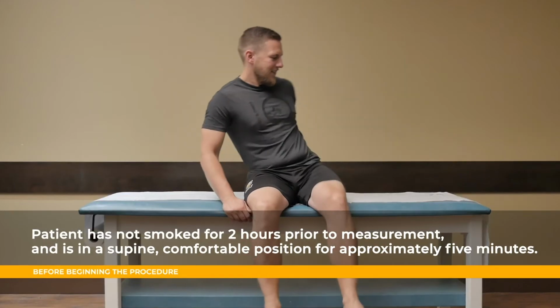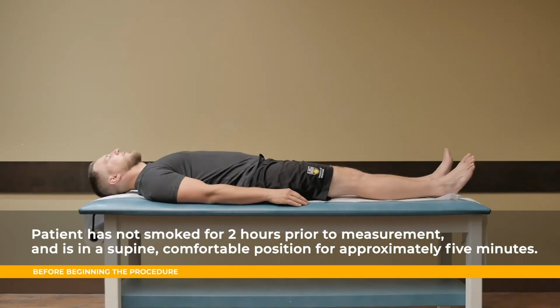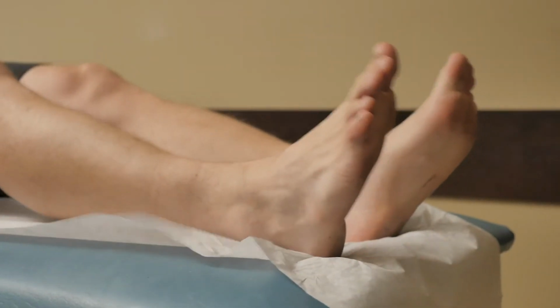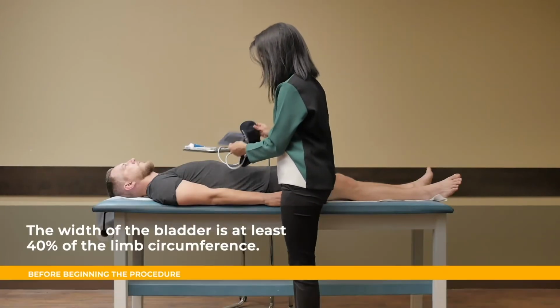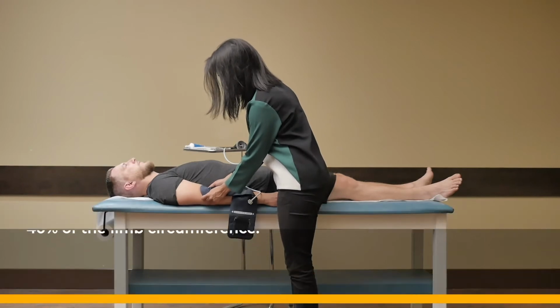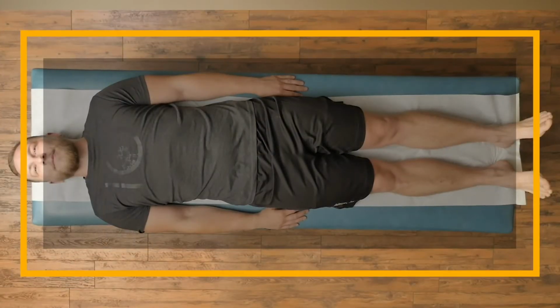To begin, ensure the patient has not smoked for at least 2 hours prior to measurement and that they are in a supine, comfortable position for approximately 5 minutes with both their head and their heel supported, and that their arm is at the level of the heart. Select an appropriately sized cuff for both the arm and the ankle, ensuring that the width of the bladder is at least 40% of the limb circumference. The procedure follows a counterclockwise direction, so starting at the right arm, then moving to the right leg, and left arm.